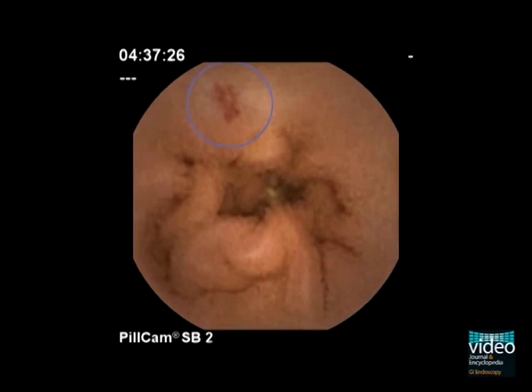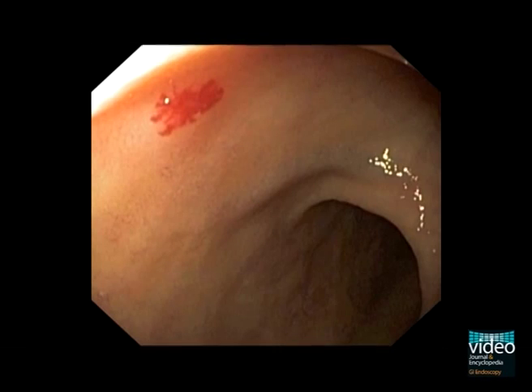The most common vascular lesions in the small bowel are angiectasias, visualized as flat, small or medium-sized red lesions.